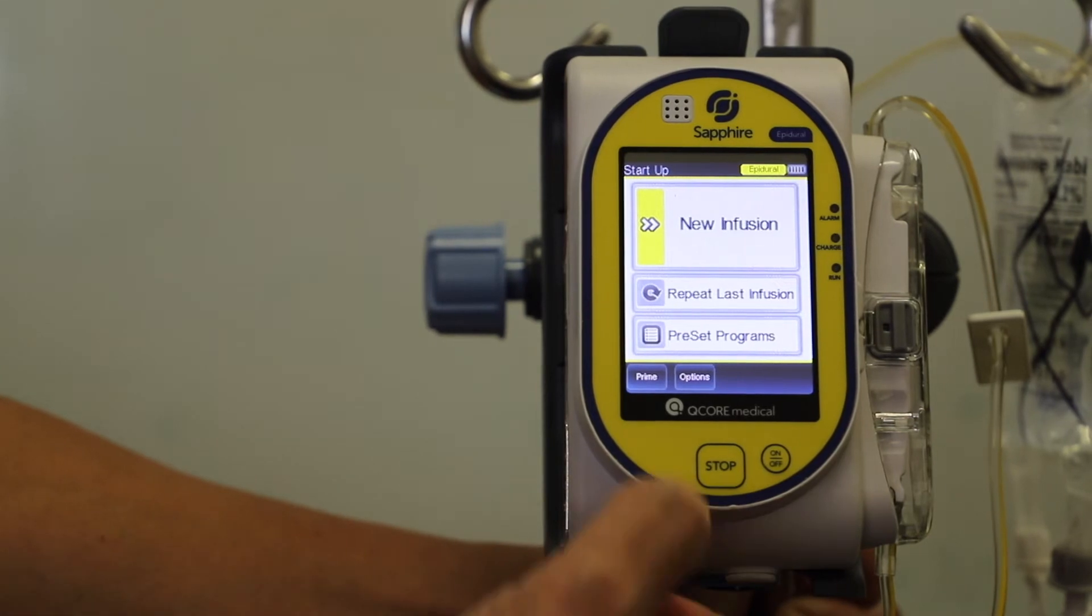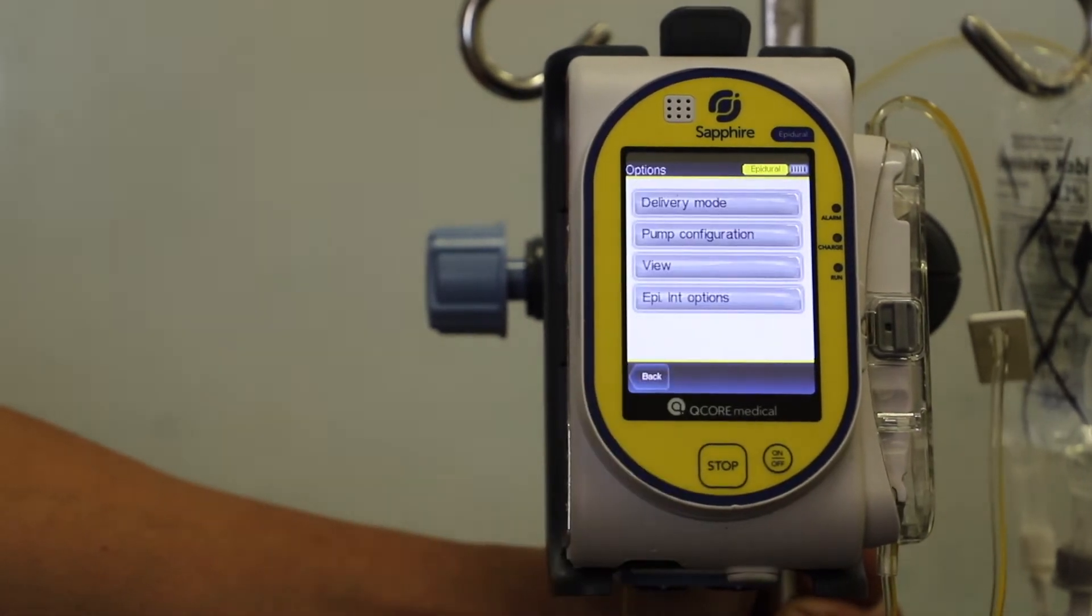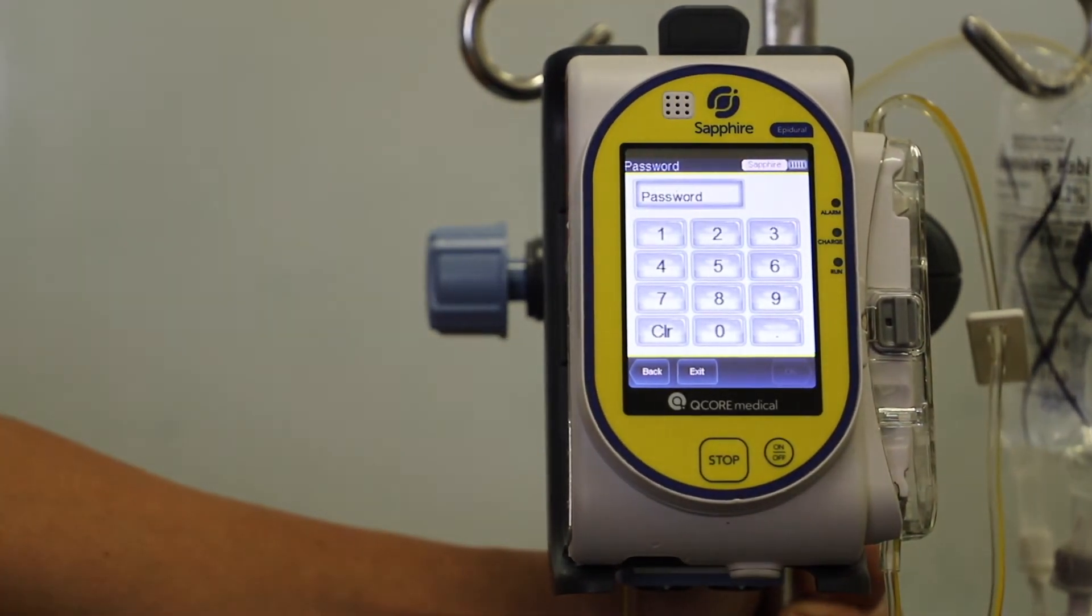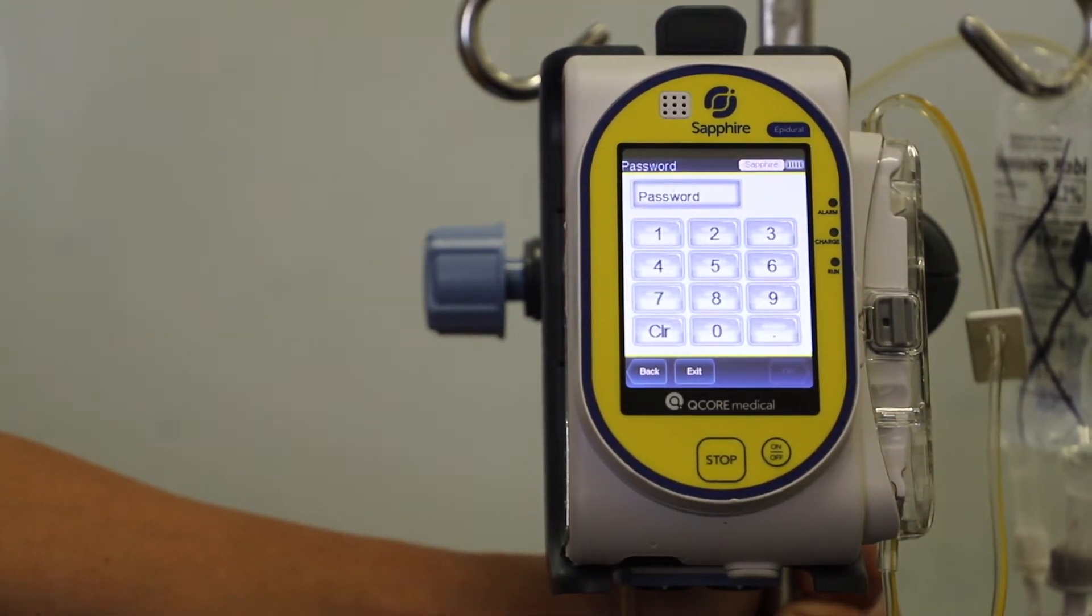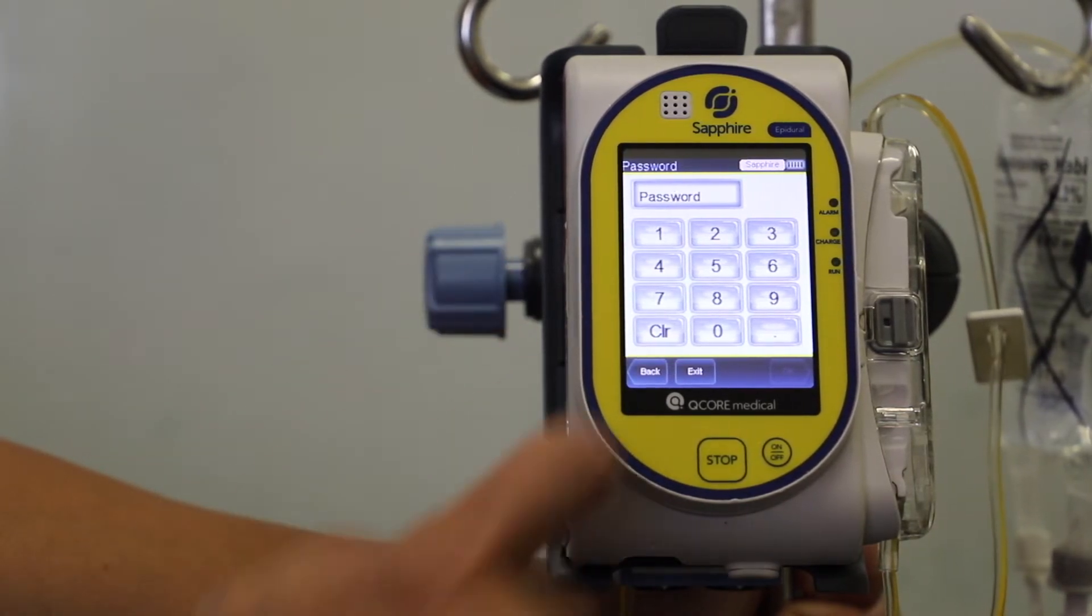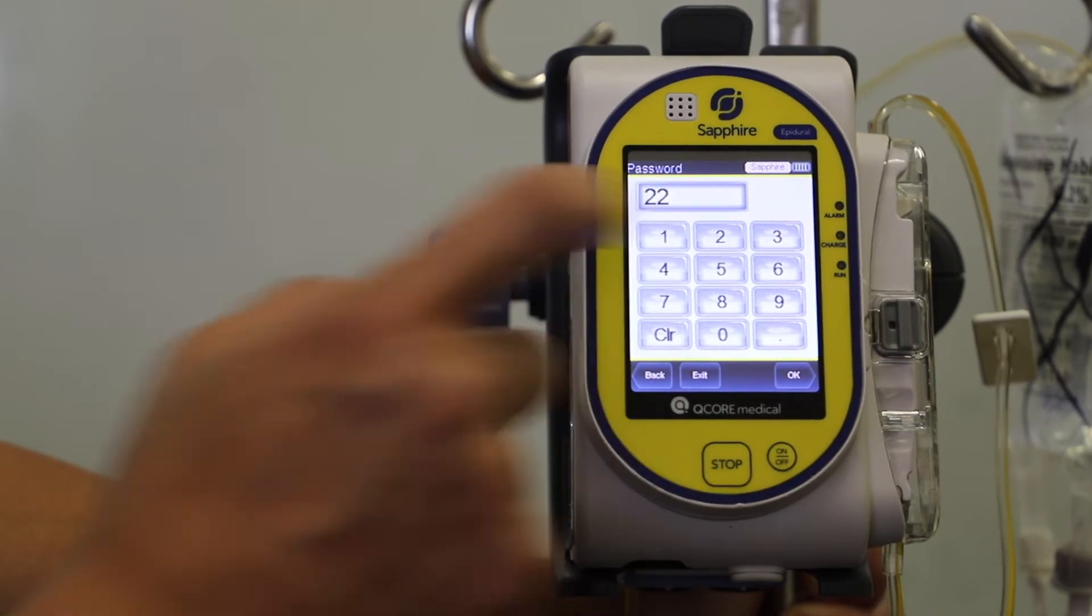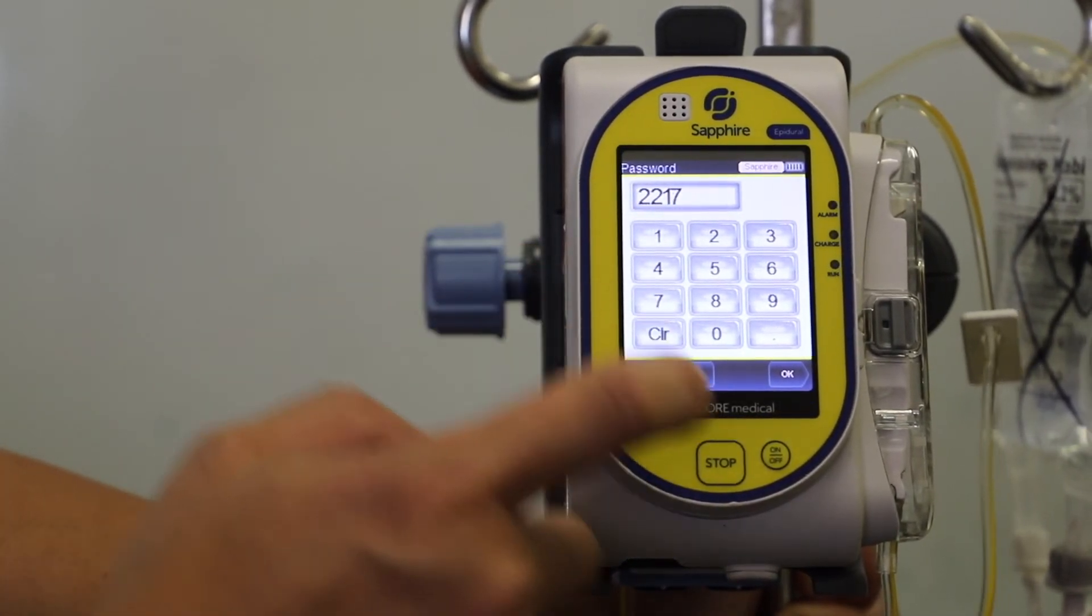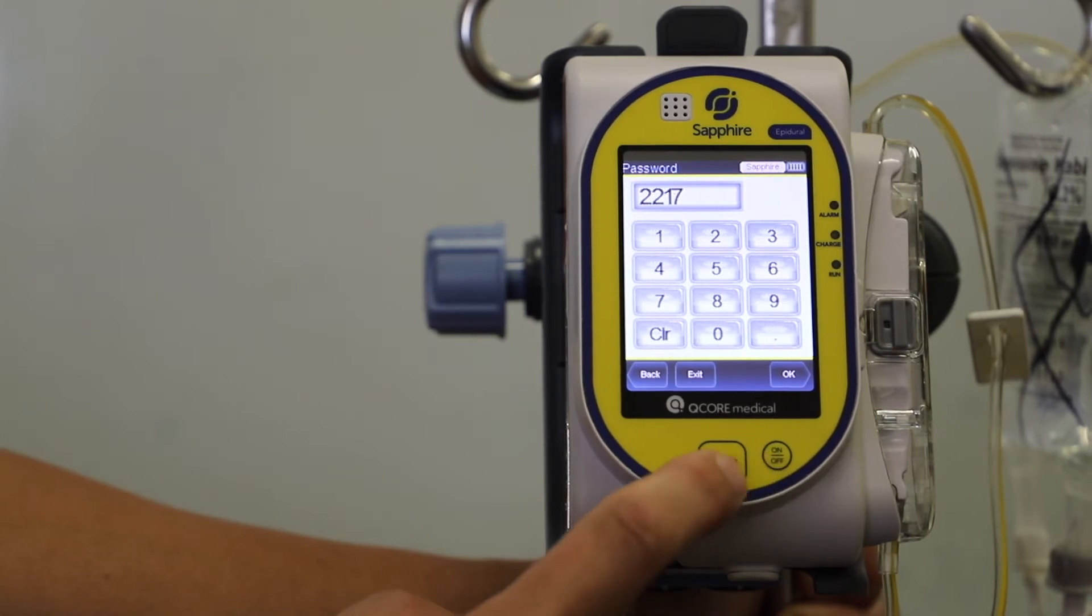So in order to do that, you go to options, go to delivery mode, put in your password, which is the 2217 postcode, and press OK.